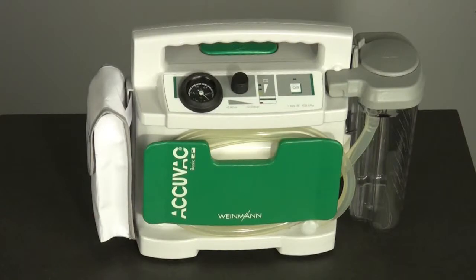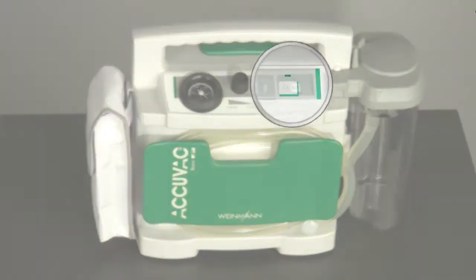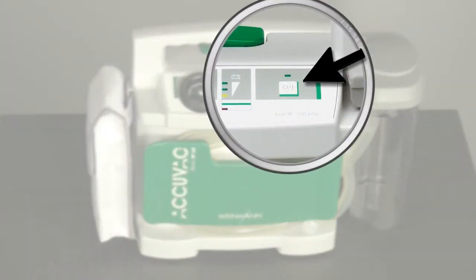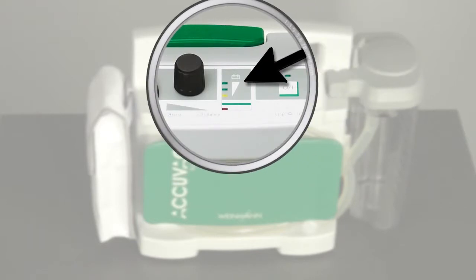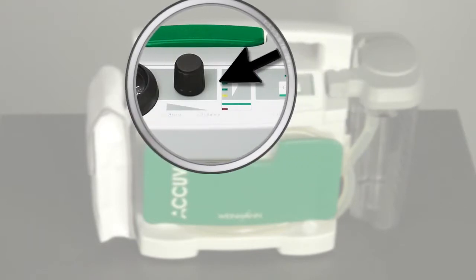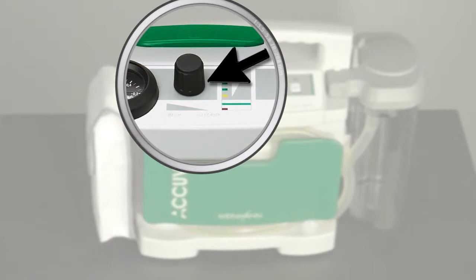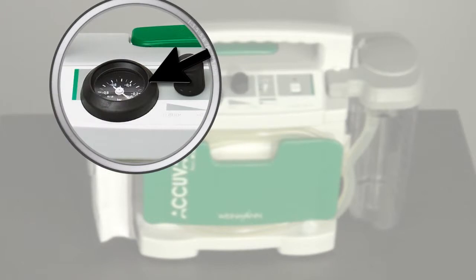All operating elements and displays are in the operating panel. The ACUVAC BASIC is turned completely on and off with the 01 key. To the left of the on-off switch is the voltage indicator. The required vacuum can be set with the vacuum control dial to the left of the voltage indicator. The vacuum setting can be read from the pressure gauge.